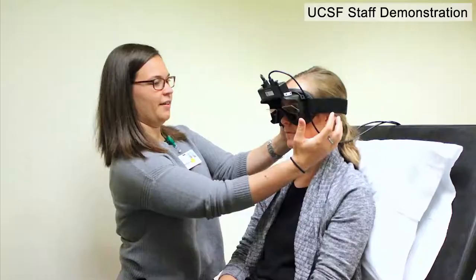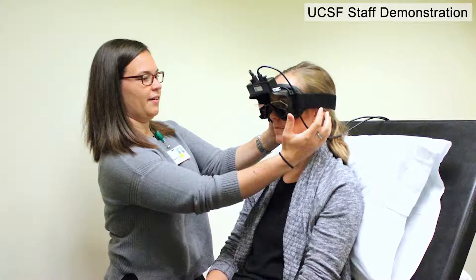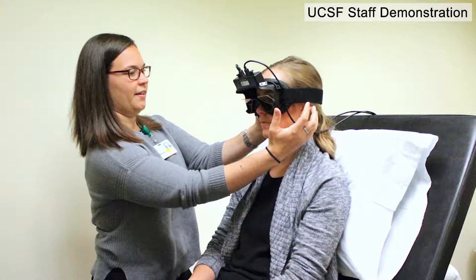Once you have your goggles on, there are several parts of the test. The first part is known as the ocular motor battery, which measures how your eyes respond to various changing and moving images while your head is kept still.